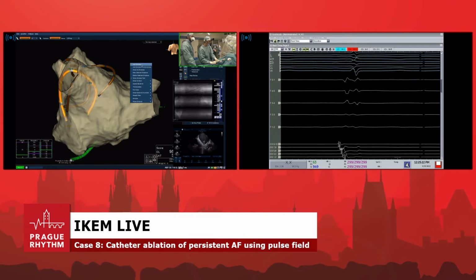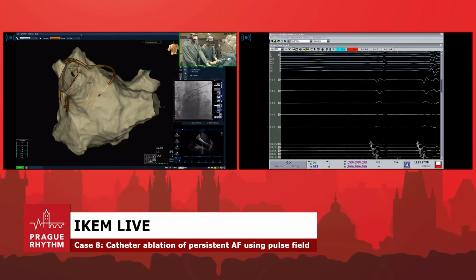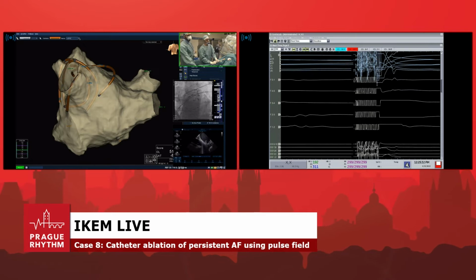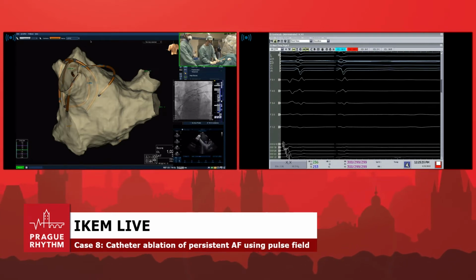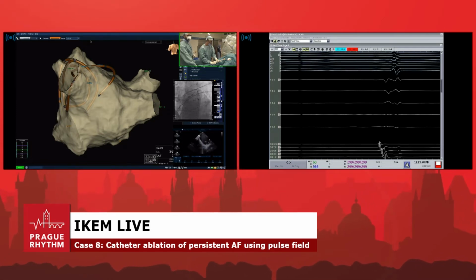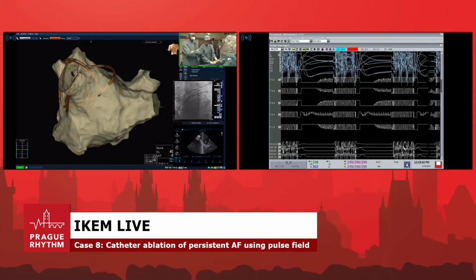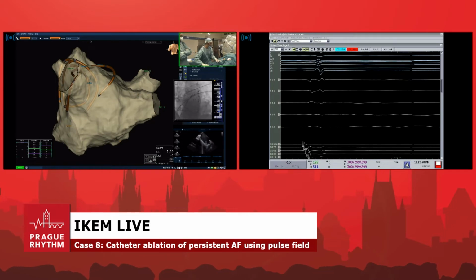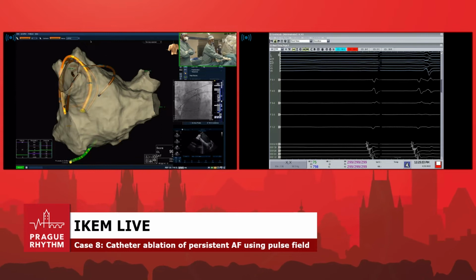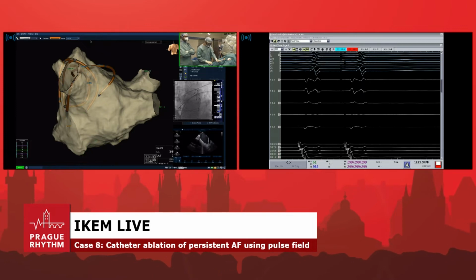Okay, I'm going to reload here. Let's go here. So LIPV, pulse 3, go. Now we are kind of in a biscuit. You see that we are having contact with the inferior rim of the trunk, which is very important here. LIPV, pulse 4. Okay, we come back in the flower. We advance. Okay, I like this. LIPV, pulse 5.